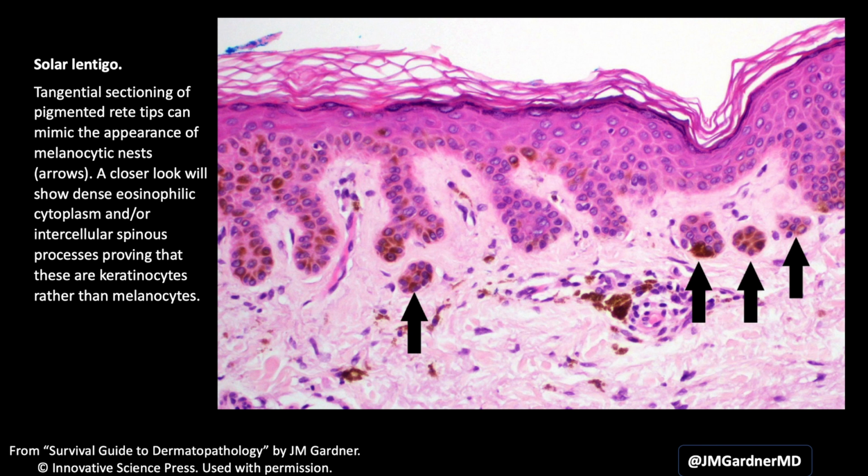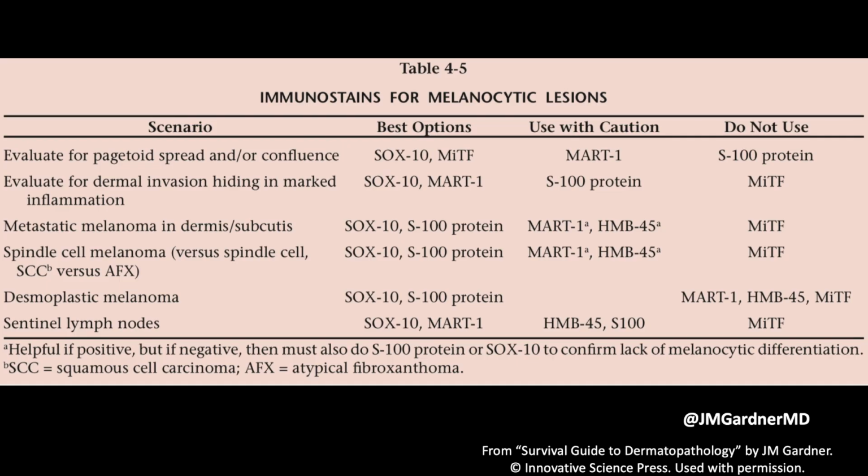So this is a solar lentigo, and these are benign, but they often get biopsied because they're on sun-damaged skin of elderly patients. And so the dermatologist will send a biopsy and say pigmented lesion, lentigo versus lentigo maligna. It's a common specimen that I see multiple times per day in my practice. So learning to sort those out is really helpful if you see any amount of skin pathology. And sometimes solar lentigos can intermingle with actinic keratosis, pigmented AKs particularly. I will often see both present on the same biopsy. So this is kind of the classic pattern. Other ones can be atrophic. I'll show you in a minute.